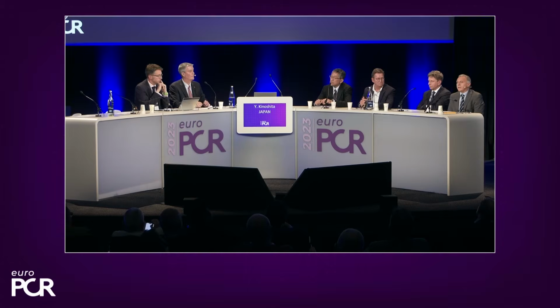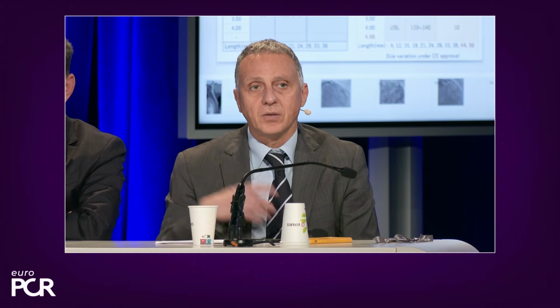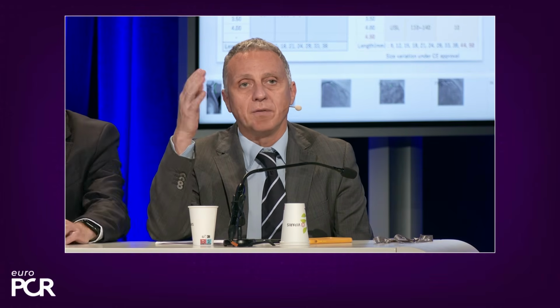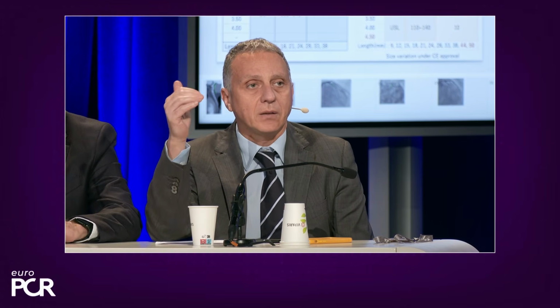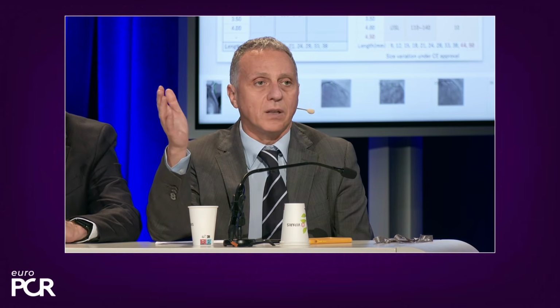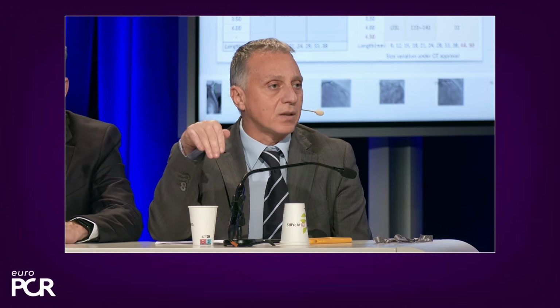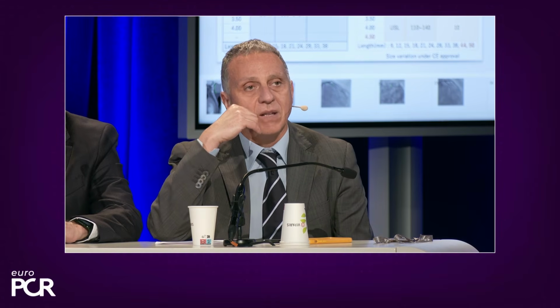Well, so I think that there is no final answer for that, because we know that the ostium of the left main has this oval shape, in which the root, in the case you are aiming at covering it, is strongly associated with the risk of having protruding stent struts into the bottom part of the ostium itself.